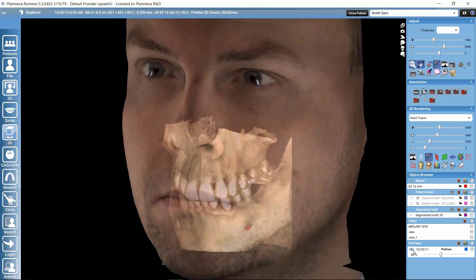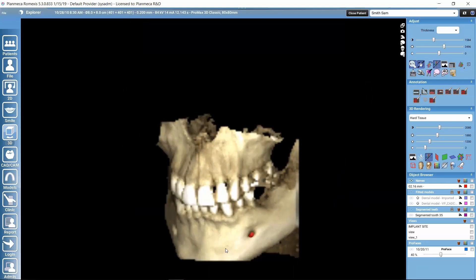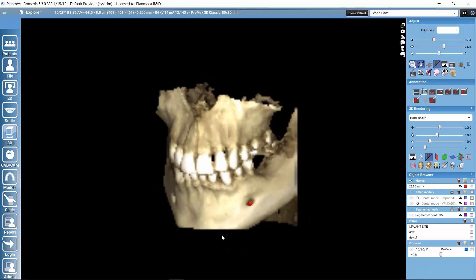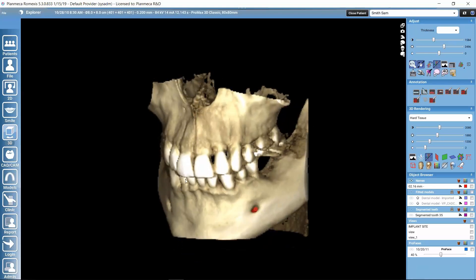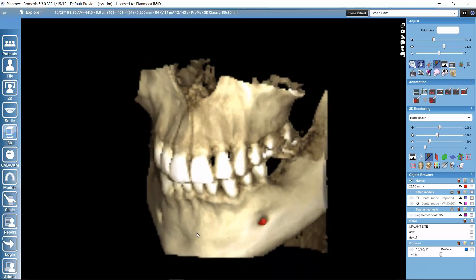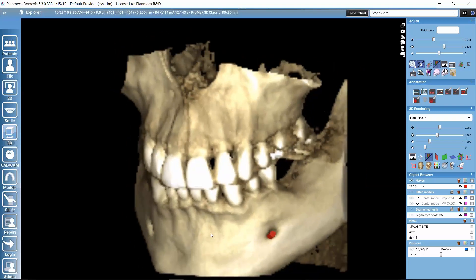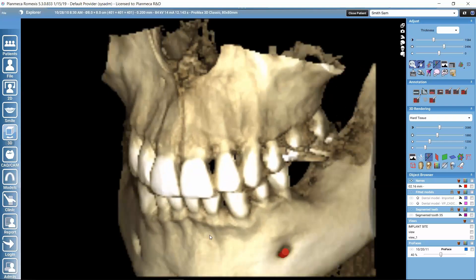Let's hide the photo for a while using the eye icon and focus on the CBCT data. To manipulate the view, the mouse wheel can be used to zoom in and out of the volume. We don't need to worry whether the toggle zoom is activated — the mouse wheel works for zooming all the time.